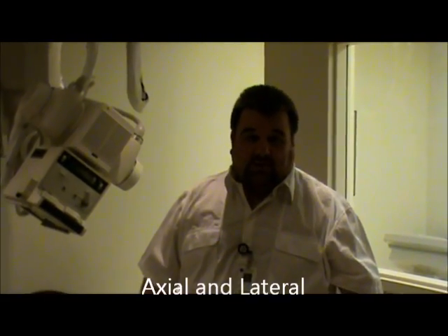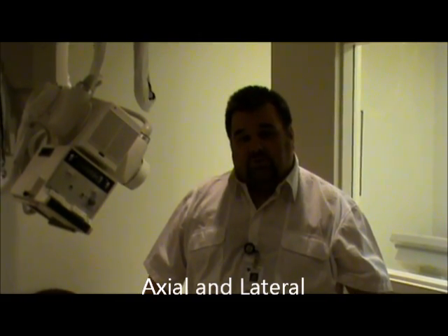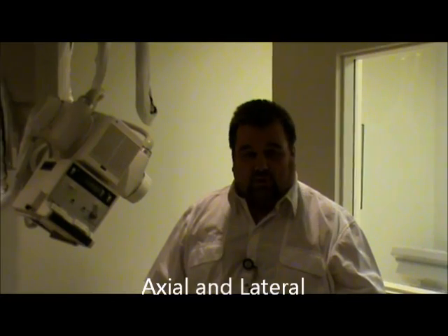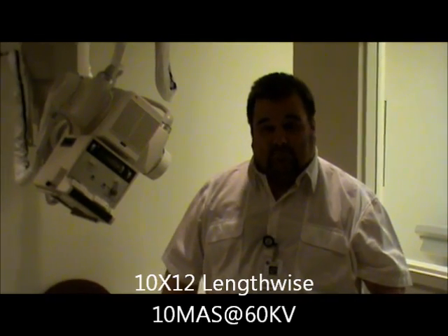Today we're going to be demonstrating the calcaneus views. The routine views for calcaneus will be an axial view, which is the plantar dorsal projection, and we're going to be doing a lateral. The film size for both will be a 10 by 12, and it will be lengthwise. The technique for the axial projection is going to be 60 kV at 10 mAs.